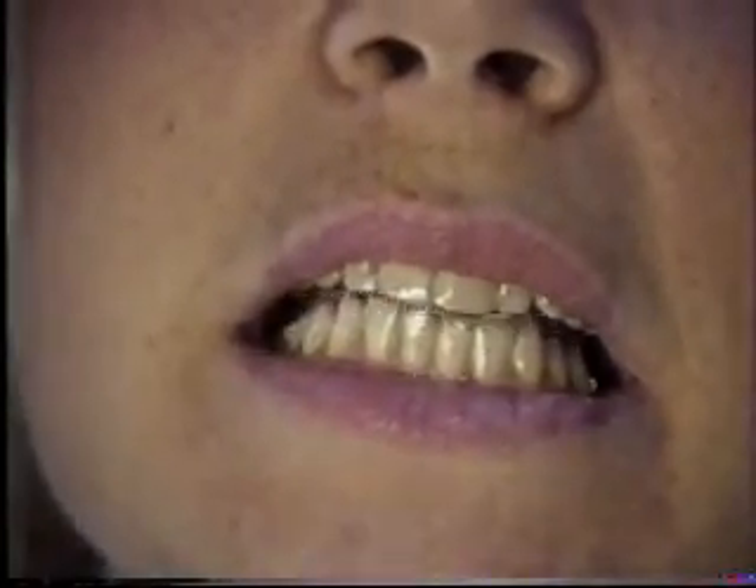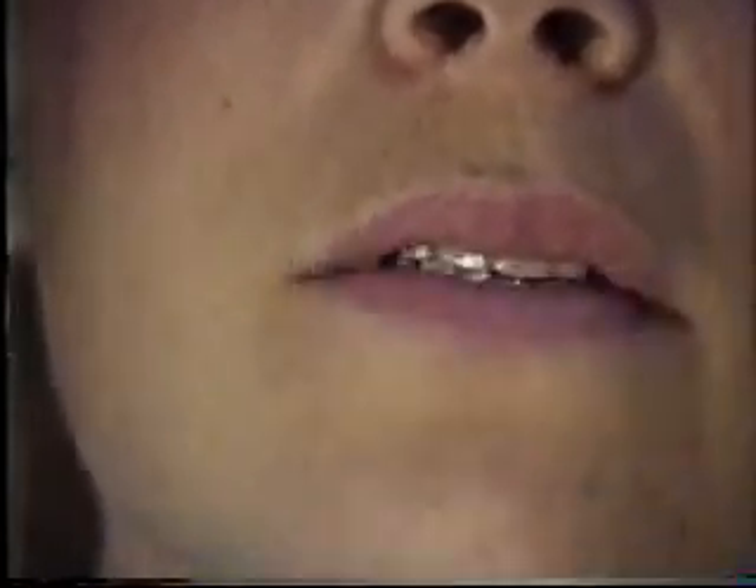What happens to your ears and your clicking when that's in? It's completely gone now, you don't feel any. But as soon as we let your jaw slide back? Then I can hear that clicking when you put your fingers in there. Is there any discomfort in your ears when you open and close now? Nothing.